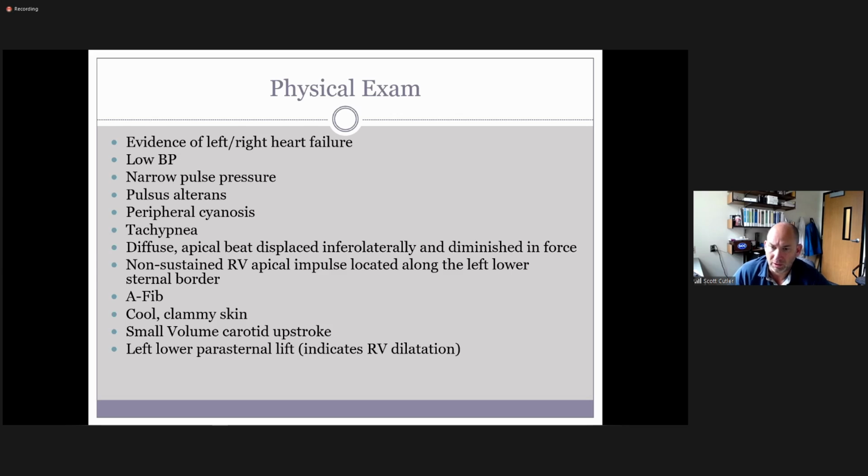If we're seeing systolic dysfunction, we already know that we are likely already having diastolic dysfunction as well. So with people on chemotherapy, for example, one of the reasons they use strain imaging is because it's an early indicator of dysfunction happening before you even start to see it actually happening.